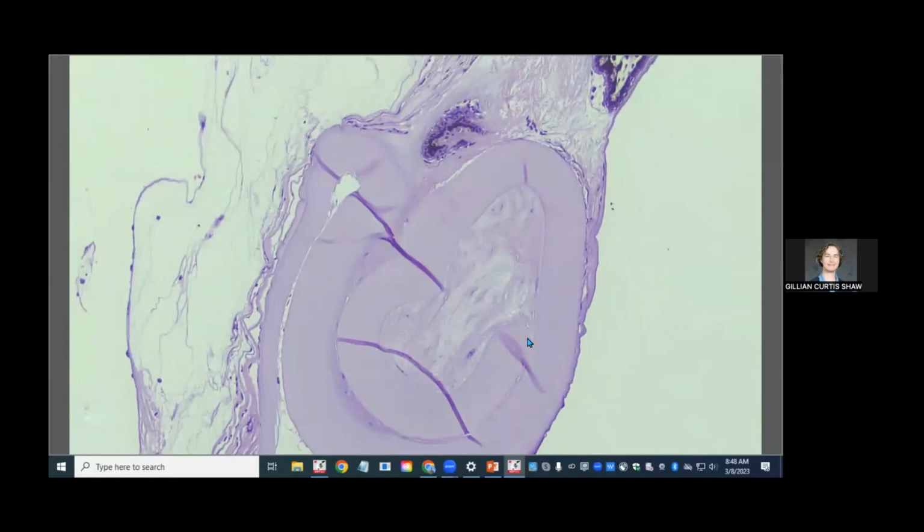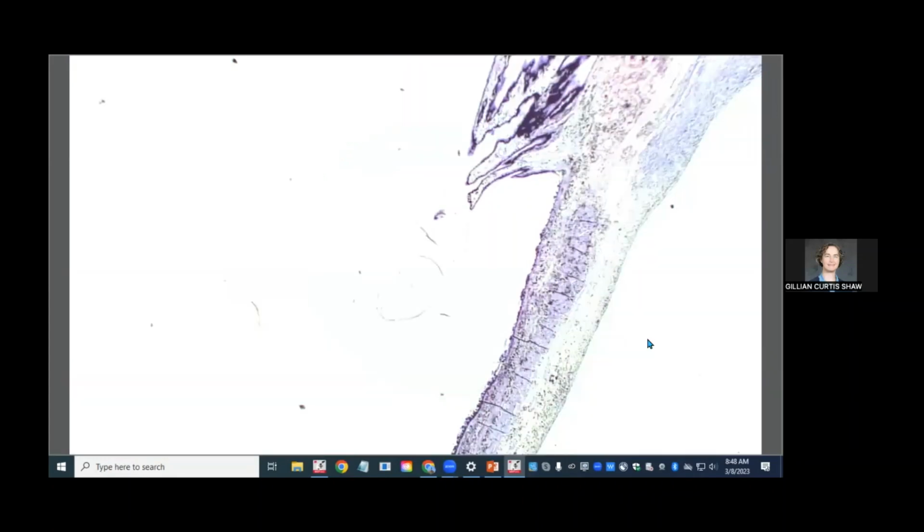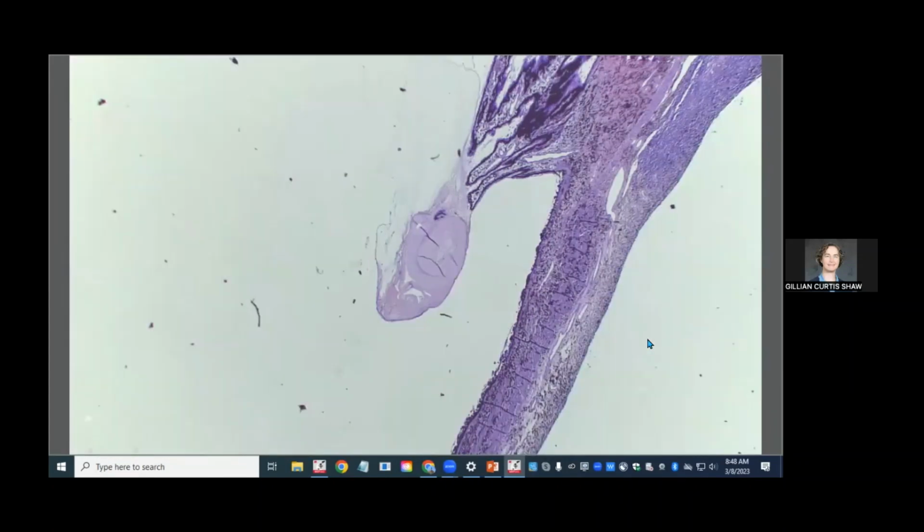And here's a break in the anterior lens capsule as well. There aren't really any normal lens fibers left. They've basically been resorbed, or more likely, surgically removed. The inside of the capsule is filled with a little bit of collagen, which was probably laid down by lens epithelial cells, which will sometimes remain and do their thing. So this is kind of a post-operative cataract eye.